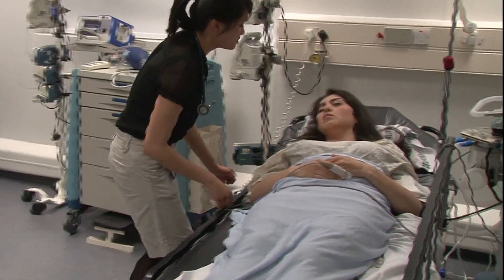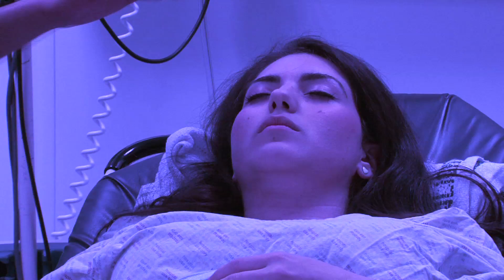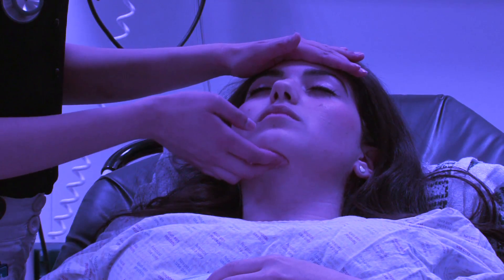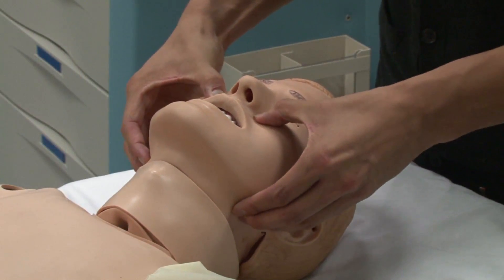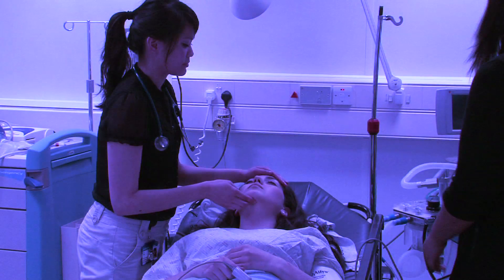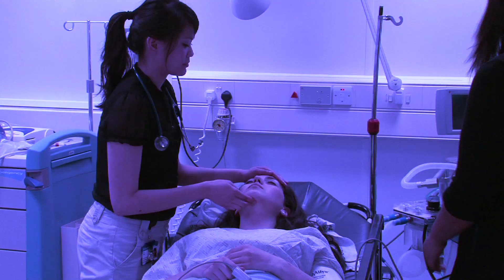Hi Ivy, I'm just going to move your head a little bit, okay? To perform a head tilt chin lift, bring the head into the central position. Place one hand on the forehead and tilt the head back. At the same time, place your fingertips under the chin and lift upwards. If you suspect a C-spine injury, you should use a jaw thrust. To do this, place the fingers of both hands behind the angle of the mandible and displace the jaw forward. The head tilt chin lift manoeuvre will open the airway. However, to maintain airway patency, an airway adjunct should be used.